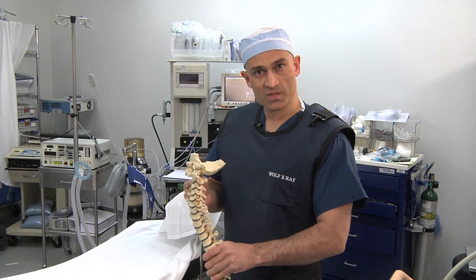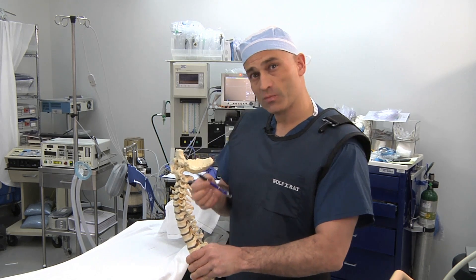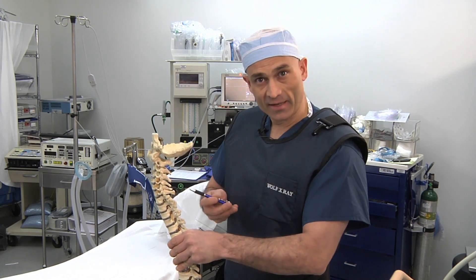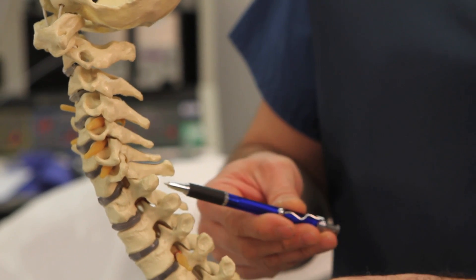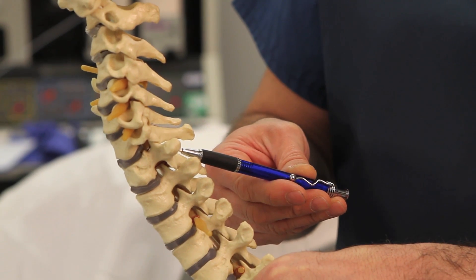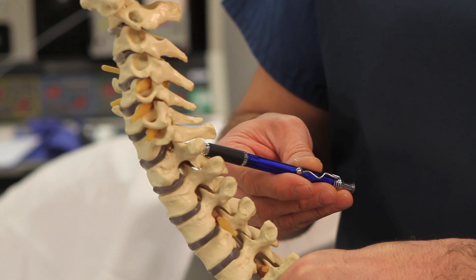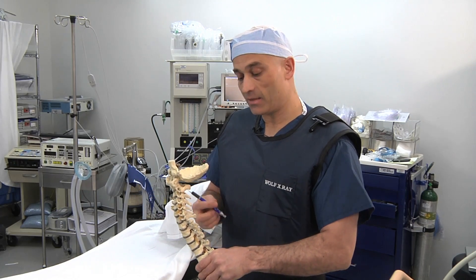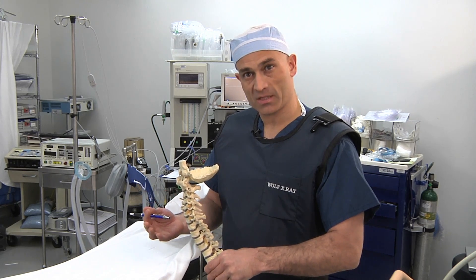The procedure involves the injection of a solution through a small needle from the back of the neck. As you can see, the needle is inserted through the spinous processes under fluoroscopic control. The needle tip is advanced up to the back of the neck to an area called the ligamentum flavum, and medicine is injected through the needle into the epidural space.